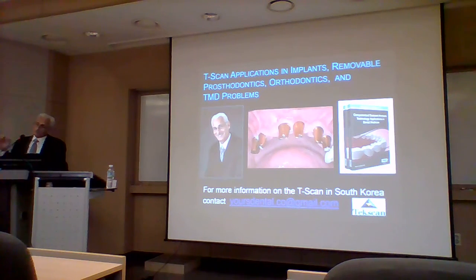And without these technologies, it becomes very difficult sometimes to resolve them. So it's better if you install well at delivery these high precision end results, or if you adjust someone's bite to make it a very high precision end result, then the physiology works optimally. But if the end result we give someone with a bite adjustment or with a denture, well, not so much with a denture, but let's say with natural teeth or implant dentistry, we create problems that result from not delivering a high precision end result. Only through measurement technology can we offer that service to our patients. So I'm glad you guys have these technologies available to you, and I hope you get to use them.